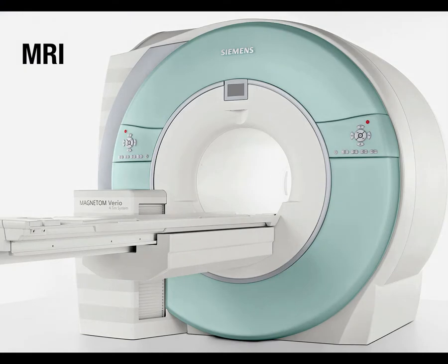And as I mentioned before, these are 1.5, 3 Tesla, 7 Tesla, even a 1.5, which is the weaker end of MRI scanners for clinical use. The magnetic field there is strong enough to pull any sort of metal out of your hand from 20 feet away, send it flying through the air and into the scanner, so there are safety risks associated with that. It also demonstrates how powerful a magnet is, and that's critical to getting good quality images.